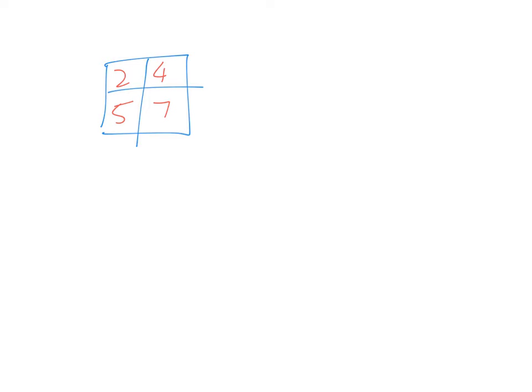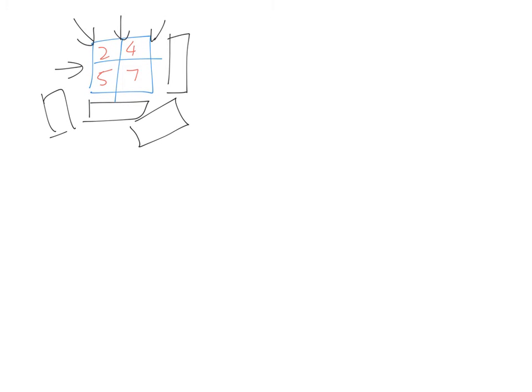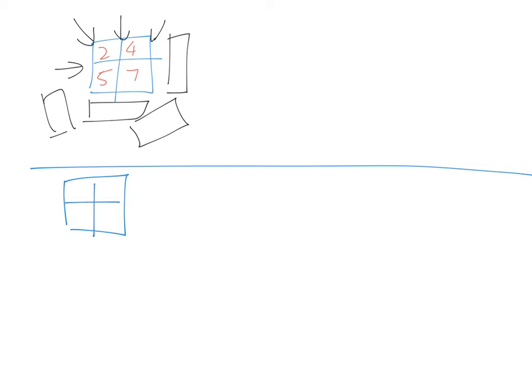So what the X-ray will do is, the tube will send in the X-rays from here, and then the detector will detect from here. Alright, then you will send from here, and then you will detect here. Then you will send here, and then you will detect here. Then you send here, and then detect here. Okay, so let's say how they calculate is like this. Let's say I do a simple calculation at the bottom here. I start off with a blank slate of numbers 0, 0, 0, 0. So the X-ray tube will send from here.